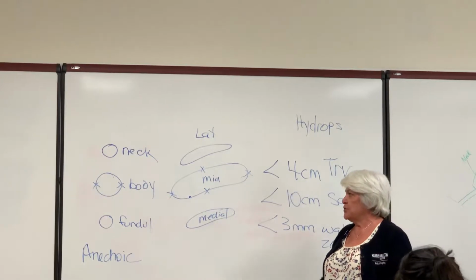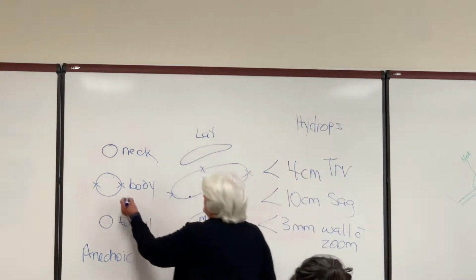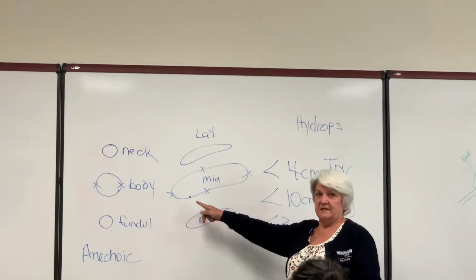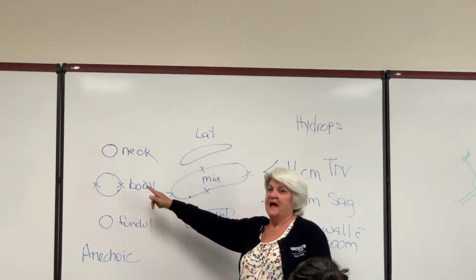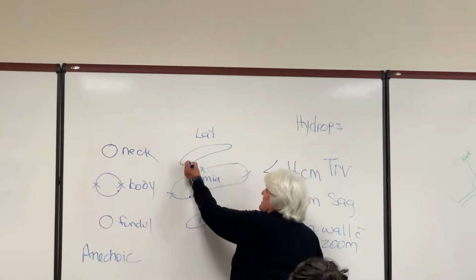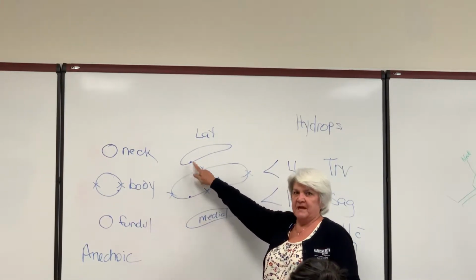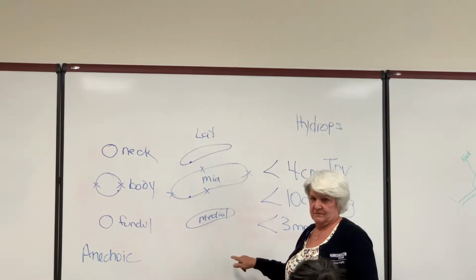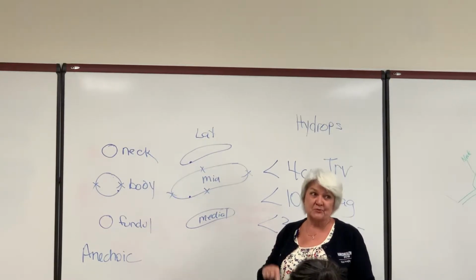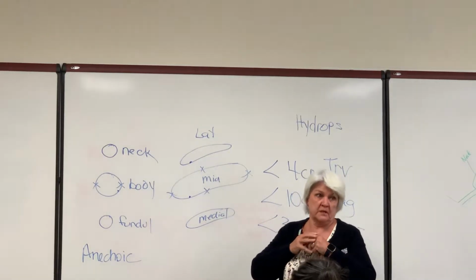Okay, so if you call me medial, because I see this, but I see this, then I know that this is lateral because you're telling me that lateral is where you saw the polyp, but I'm seeing it at medial. Does that make sense? So don't lie, because there's ways for us to check it. And the radiologist will call you on it.